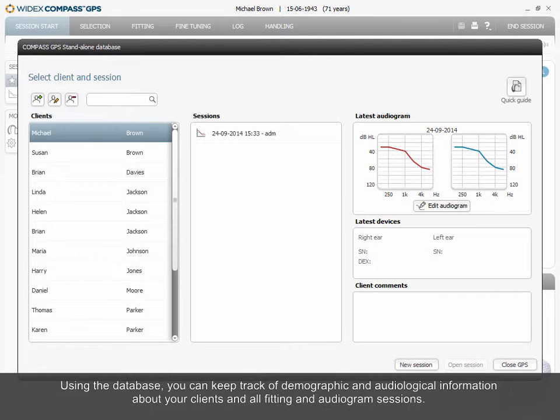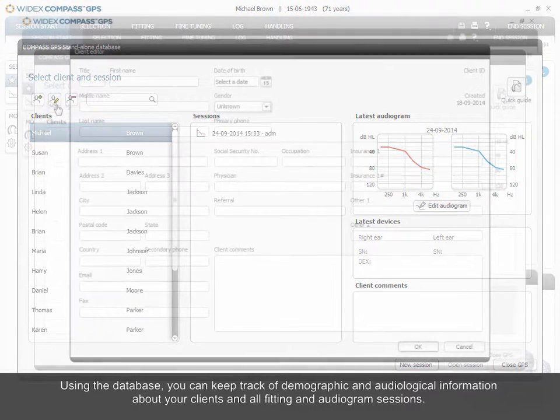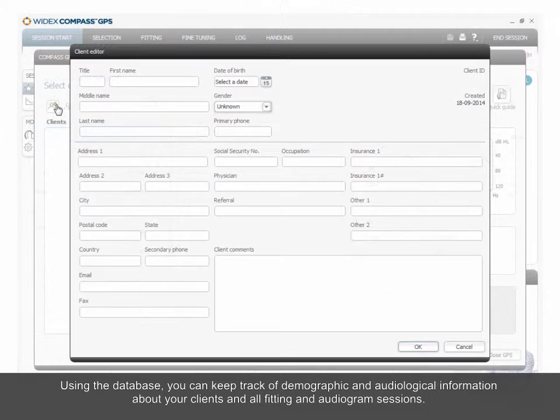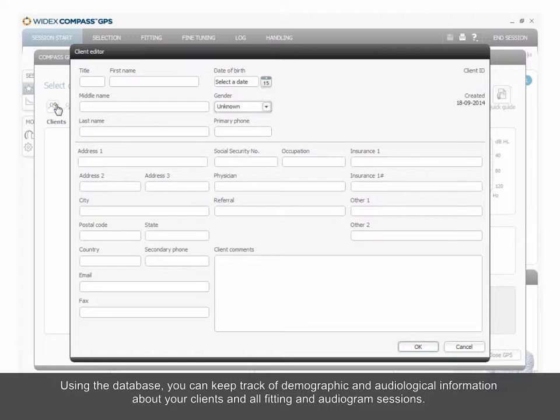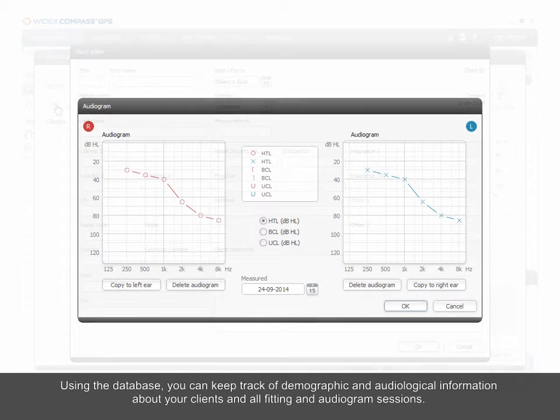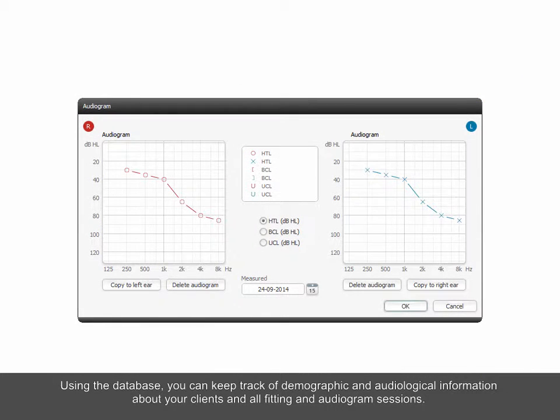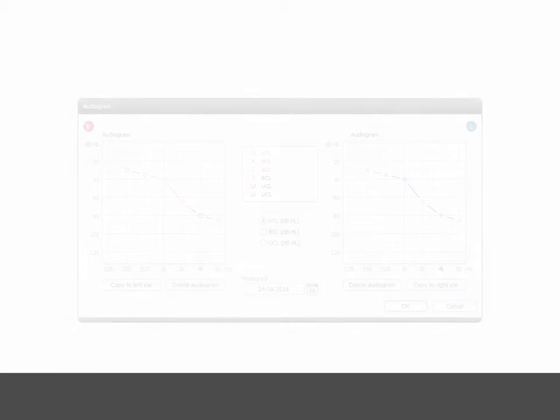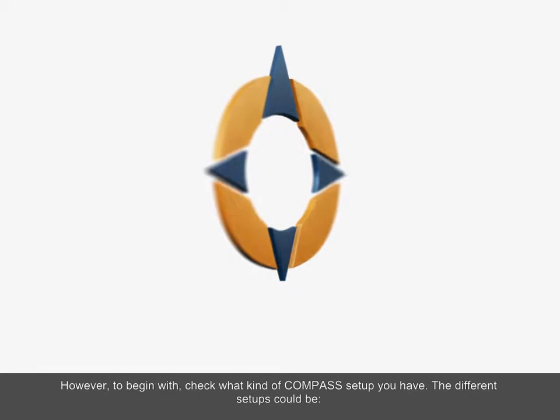Using the database, you can keep track of demographic and audiological information about your clients and all fitting and audiogram sessions. However, to begin with, check what kind of Compass setup you have.